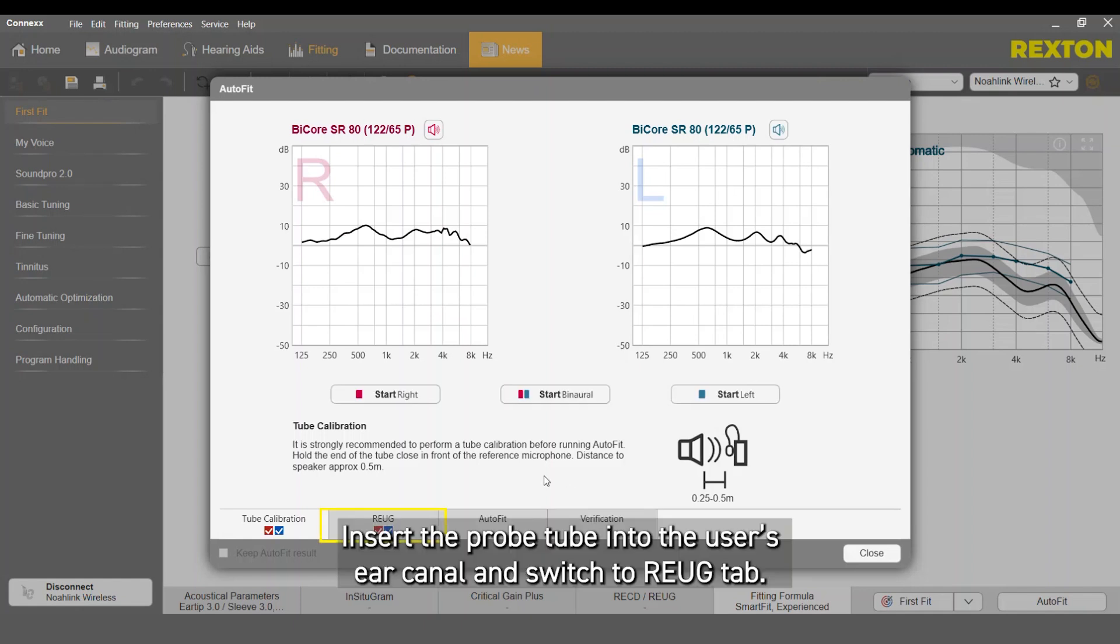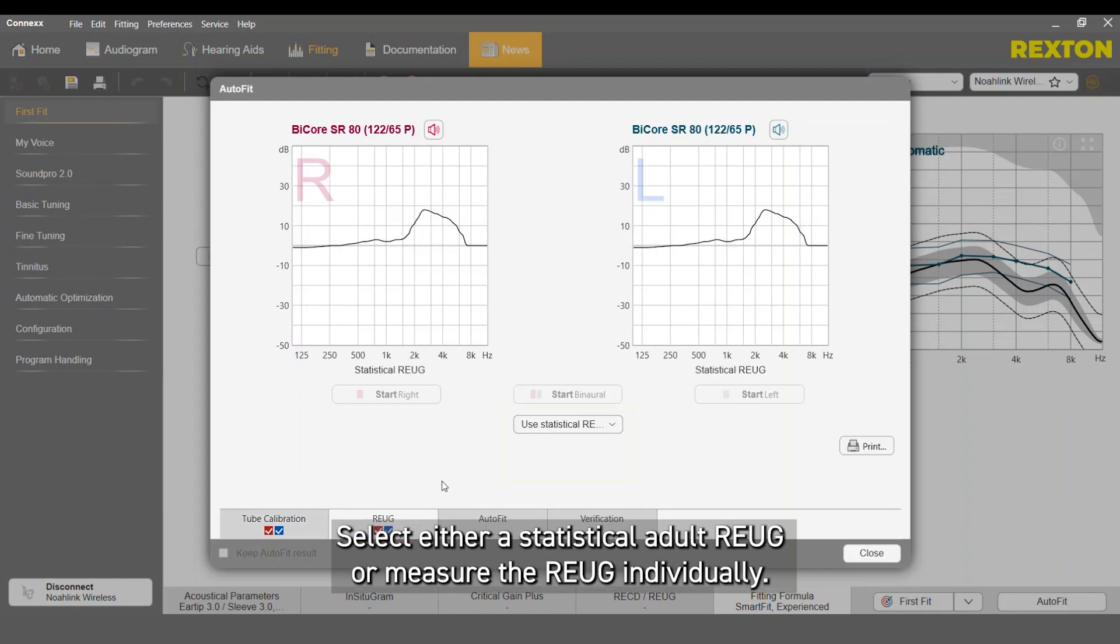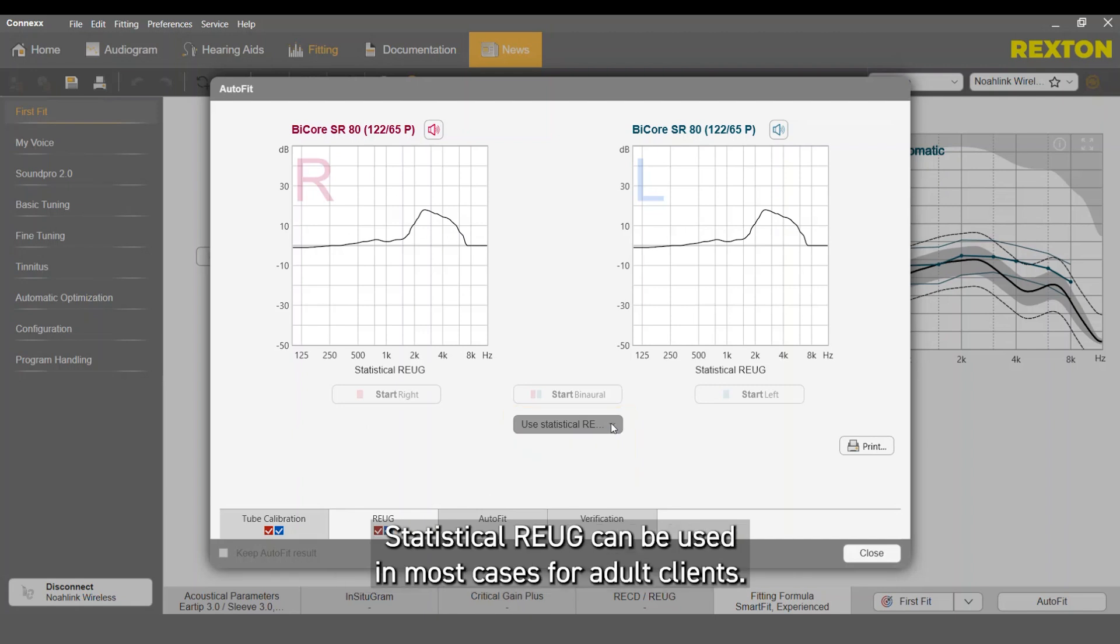Insert the probe tube to the user's ear canal and switch to the REUG tab. Select either a statistical adult REUG or measure the REUG individually. Statistical REUG can be used in most cases for adult clients.